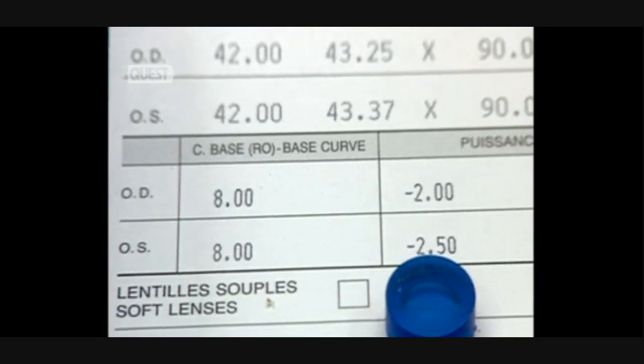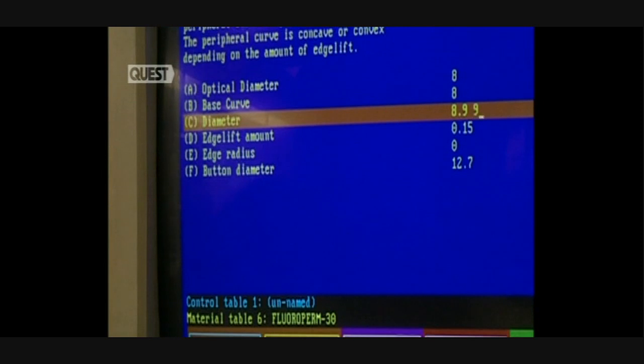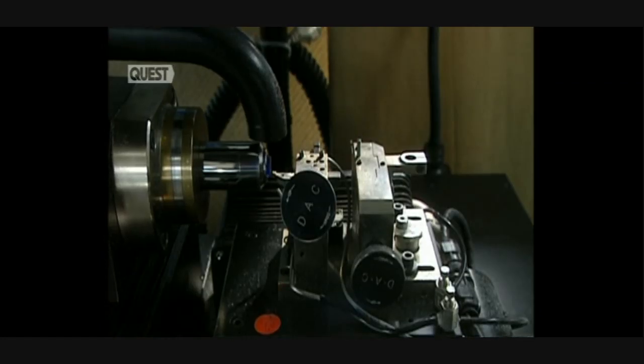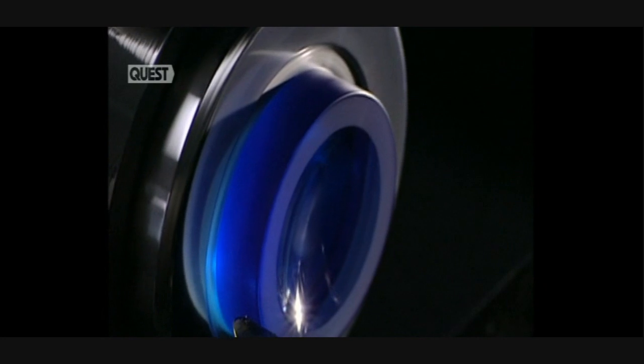The place to start is with a patient's prescription, which has been digitized for the process to begin. The first stage begins with the data processing control of the shaping. The lathe commences by shaping the inner curvature of the lens, rotating at 6,000 revolutions per minute, armed with an industrial diamond. It shapes the inner surface — the part that touches the cornea.